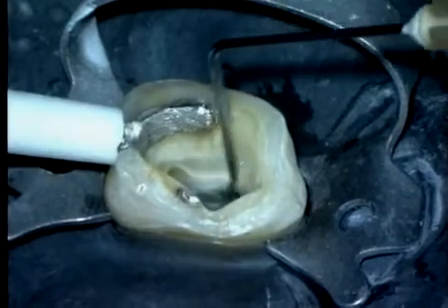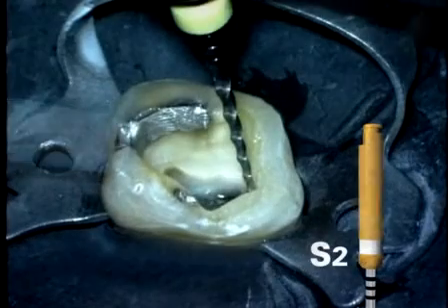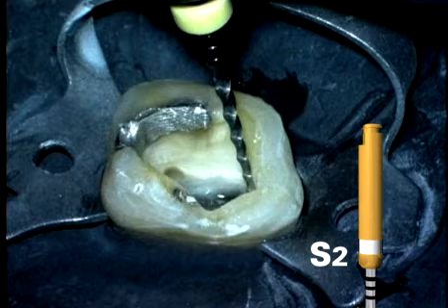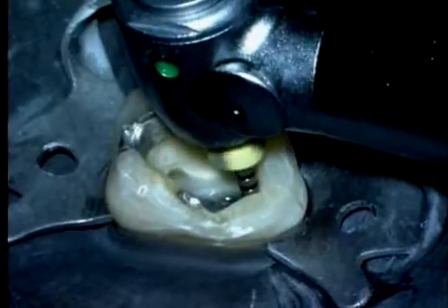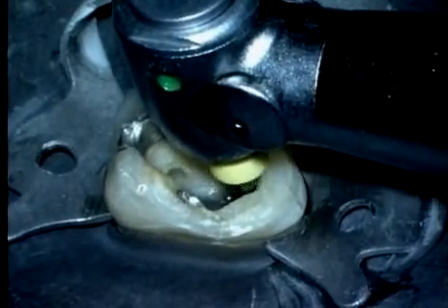Following the use of Shaper 1, we irrigate, recapitulate, and re-irrigate. This gives us confidence to proceed with Shaper number 2. Shaper number 2 will generally follow the glide path and achieve length on its first pass. When we're at length, the instrument is immediately withdrawn as the shape has been cut.